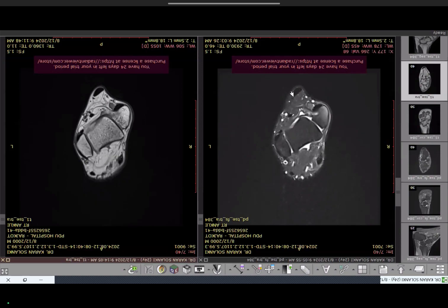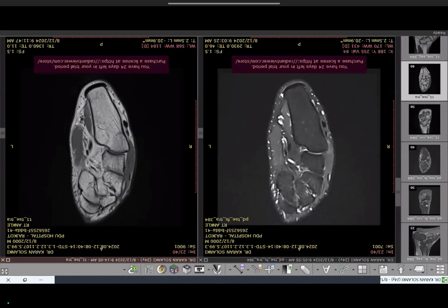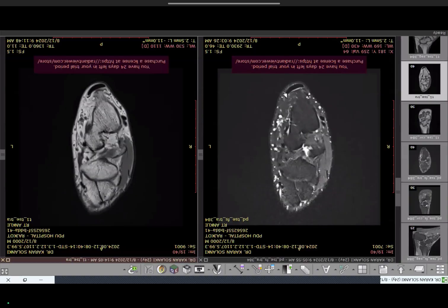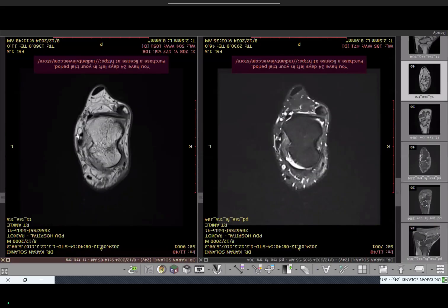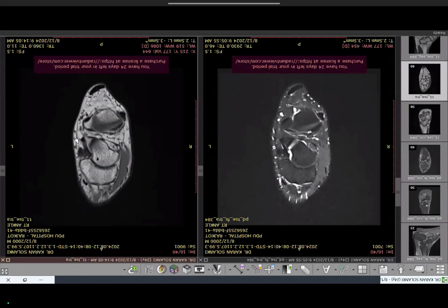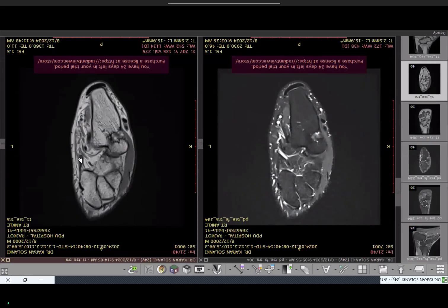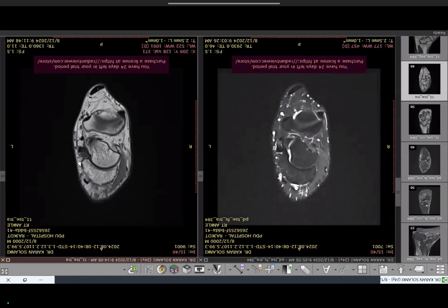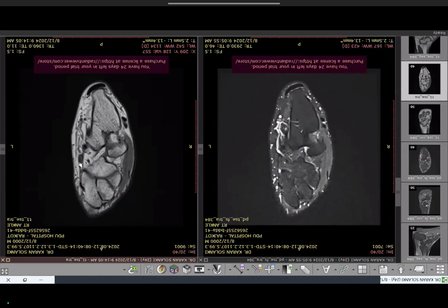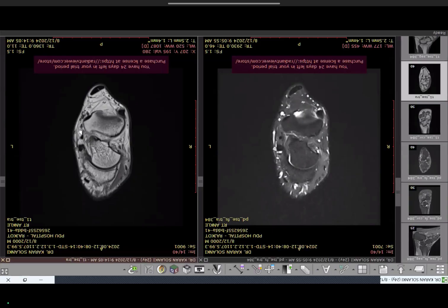Also look at the tendo Achilles at its insertion within the calcaneum and the small plantaris tendon on the medial aspect. In the posteromedial aspect we have the three tendons: tibialis posterior, which has multiple insertions with the biggest at the navicular bone, giving a slip also to the base of the medial cuneiform. Then flexor digitorum longus.